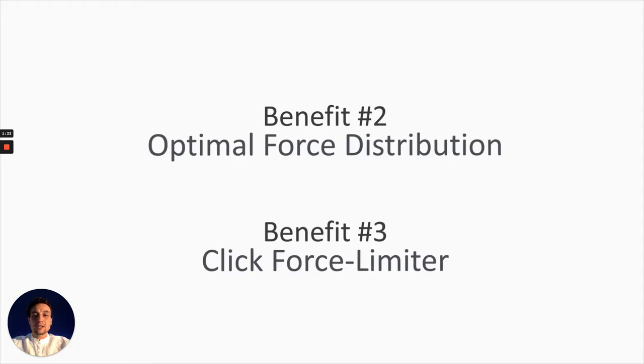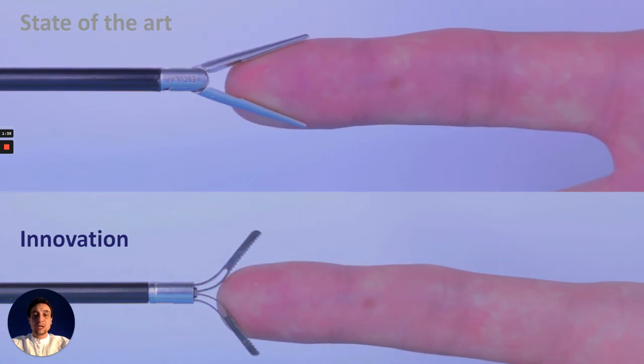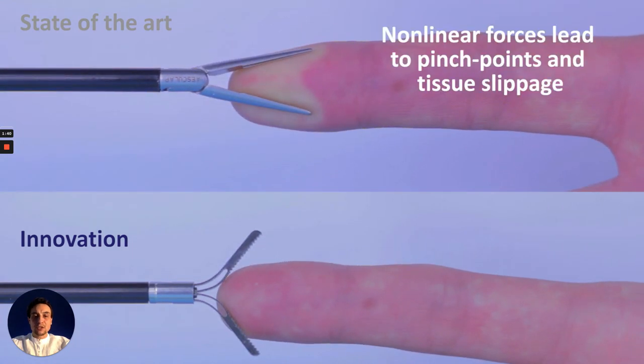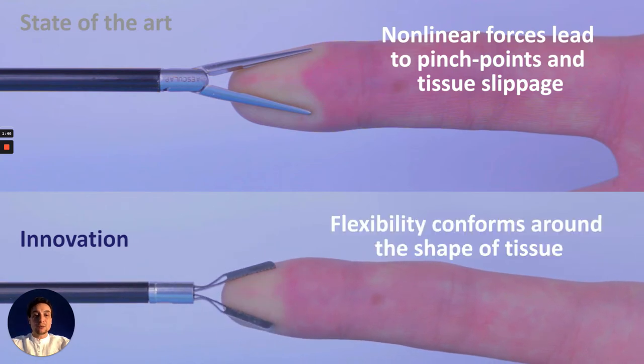State-of-the-art is also known to apply nonlinear pinch forces that can lead to pinch points and tissue slippage. A compliant tooltip can conform around the shape of tissue for optimal distribution of pinch force.